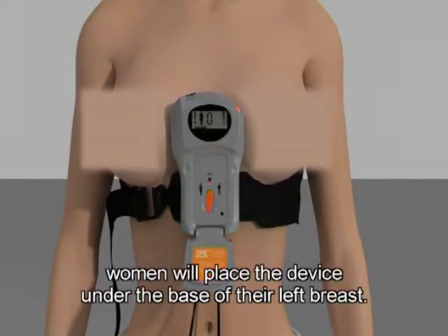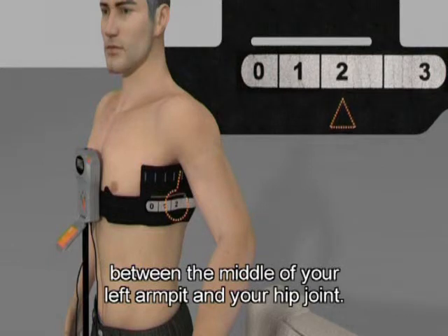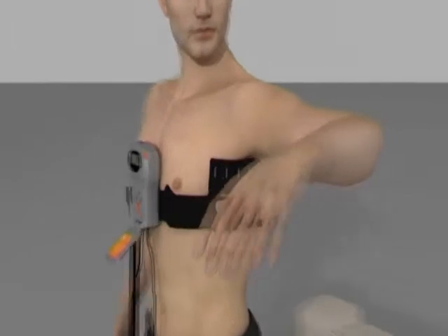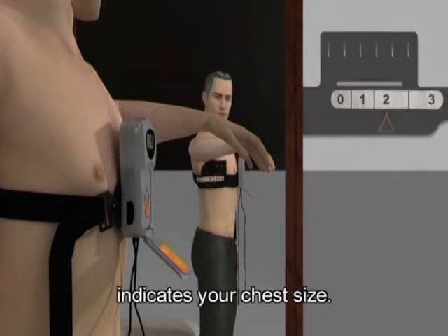Women will place the device under the base of their left breast. Draw an imaginary line between the middle of your left armpit and your hip joint. The digit displayed on the electrode belt at the point intersecting the imaginary line indicates your chest size.